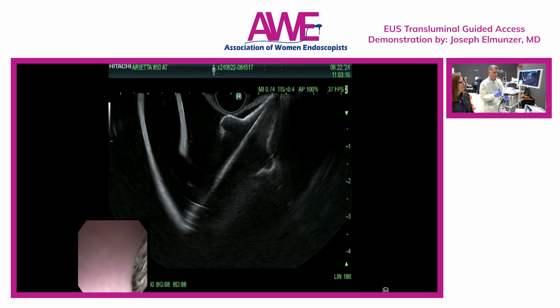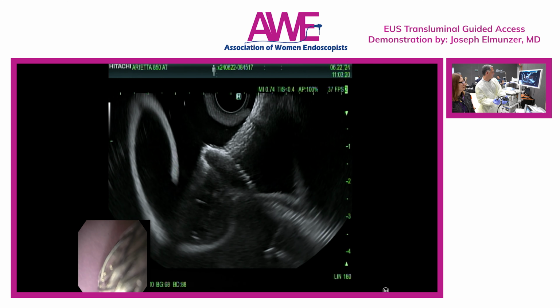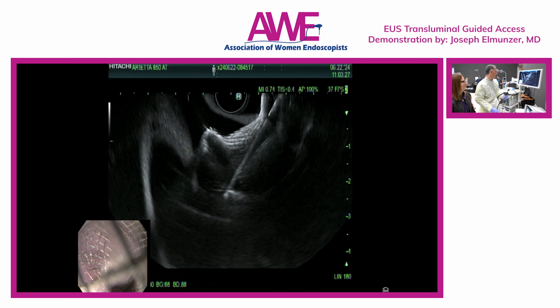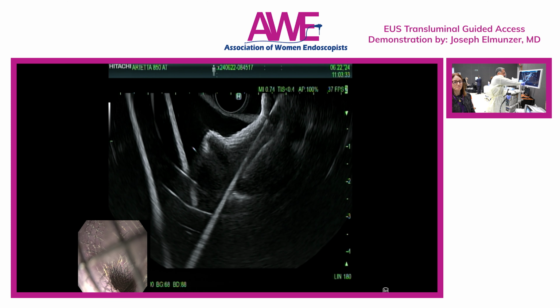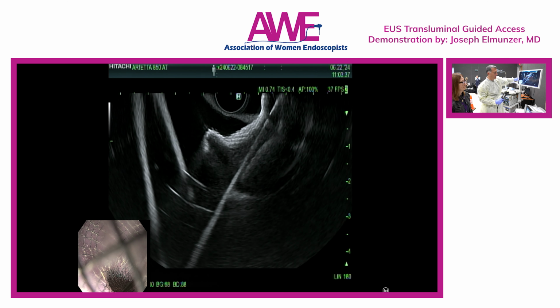So we'll see if we can do that. We're going to push the catheter out, and then we'll use the plunger to get the rest of it out, and then we've deployed successfully. And then sonographically you can see the saddle across the wall, and again this nose cone catheter is in the target, so you're totally fine now to advance the wire through if you want.